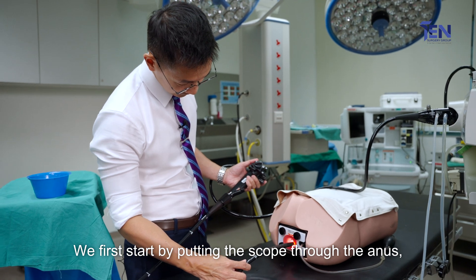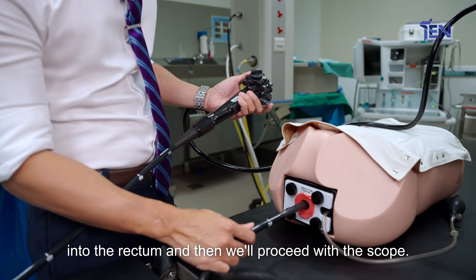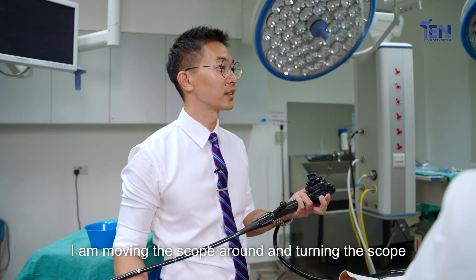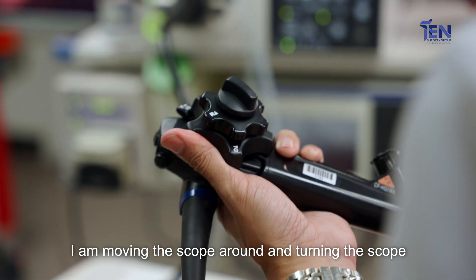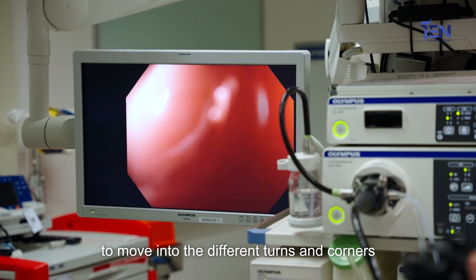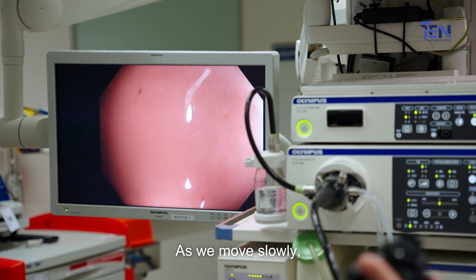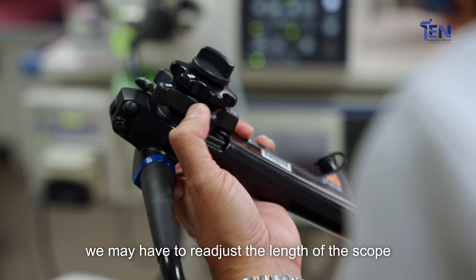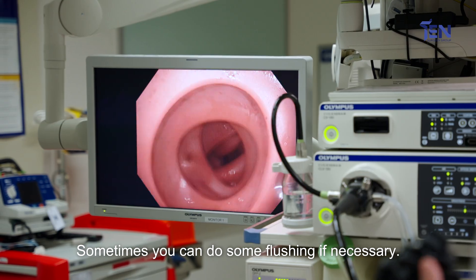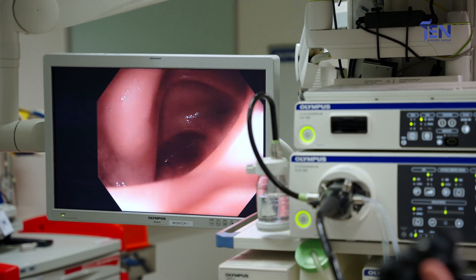We first start by putting the scope through the anus into the rectum and then proceed from here. Using the controls, I'm moving the scope around and turning it to move into the different turns and corners of the large intestine. As we move slowly, we may have to readjust the length of the scope so that we don't cause any injury. Sometimes we can do some flushing if necessary.